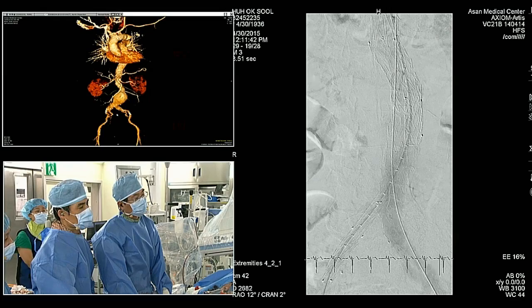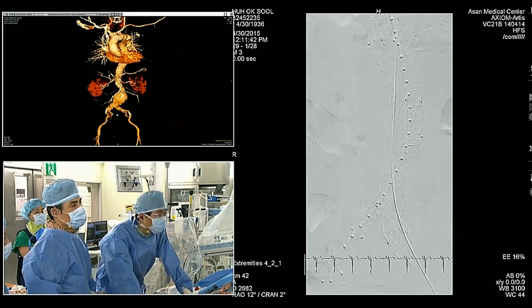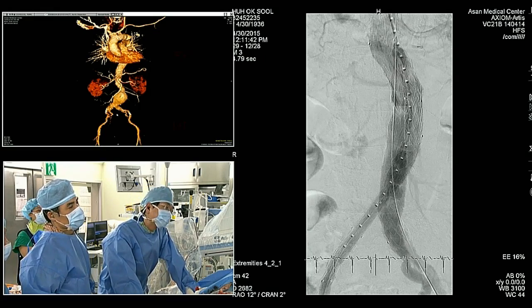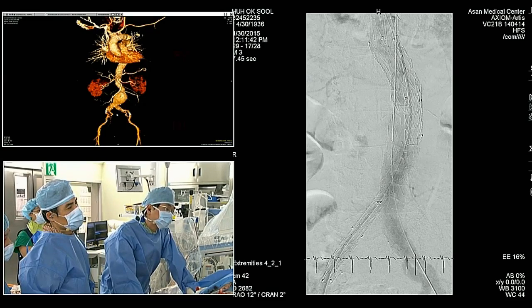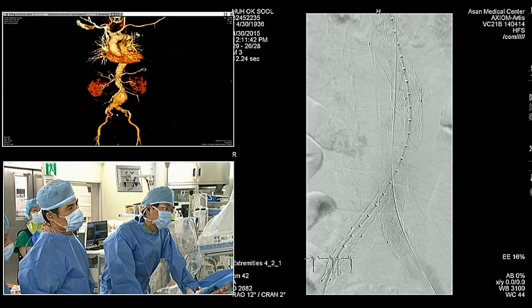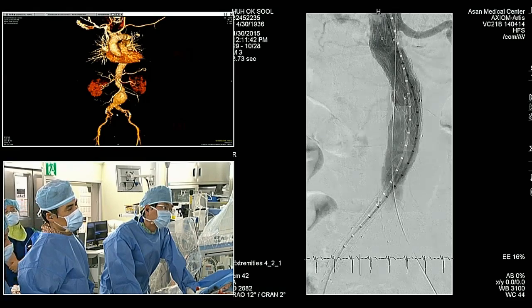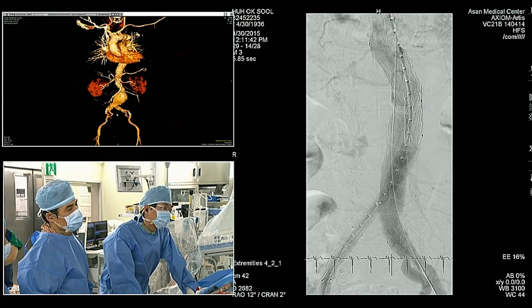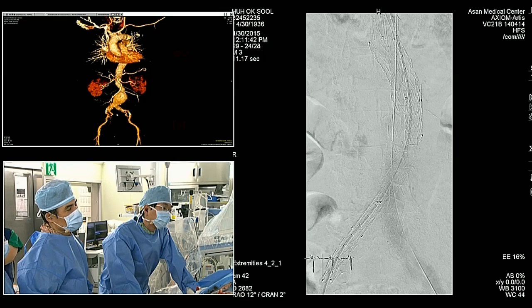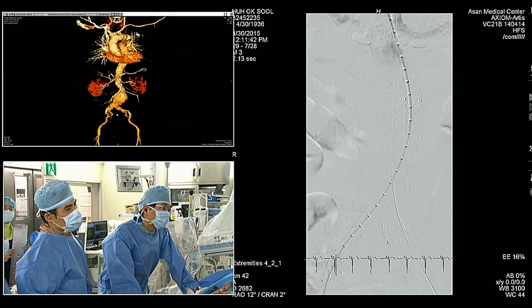So, points well taken. Still bringing up the issue of main body deployment from the left versus right. The panelist was suggesting it would be better to have done this from the right side, and then you could more precisely land your iliac extension on the left all the way down to the bifurcation without covering it. That being said, you have good coverage and the outcome's good here, but as far as discussion of technique, perhaps tell us what your thought process was. Primary bifurcate deployment, left versus right.